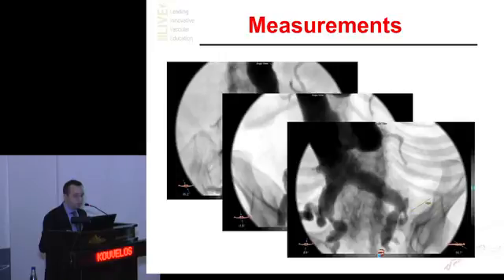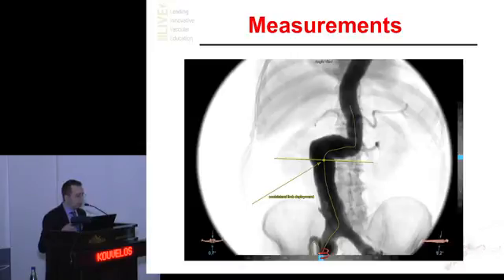We can see the DSA simulator given by the 3D reconstruction program: the proximal neck, here's the aortic bifurcation with the 2 iliacs, and here's the external iliac artery as it was shown in the angiography. And here is the simulator image where the program shows us where the contralateral limb will open.